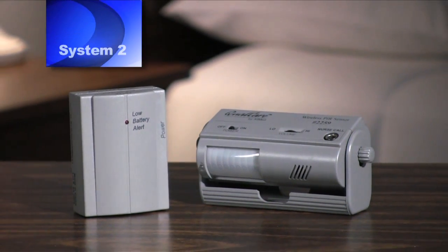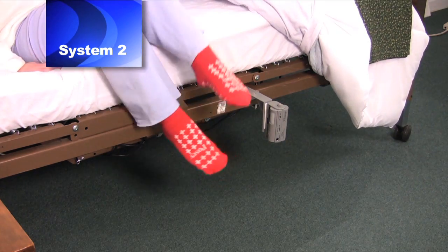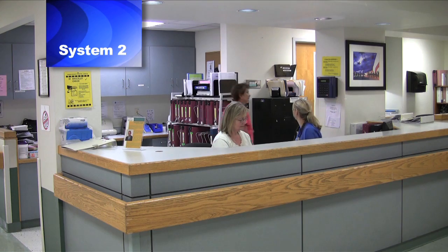System 2 is an upgrade of System 1, including both a sensor device and a nurse call receiver that allows the alarm to sound at both bedside and at the nurse's station. It can also be set to silent so it will sound only at the nurse's station. For more detailed instruction on System 2, please see video 2.